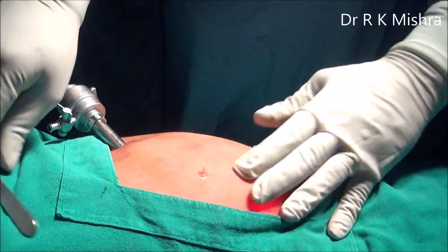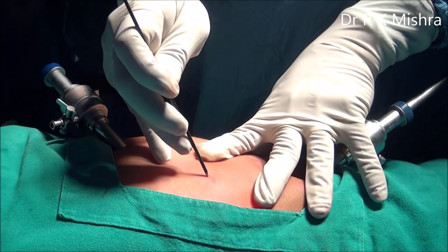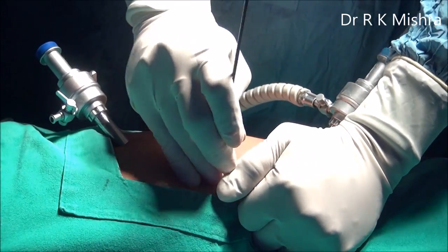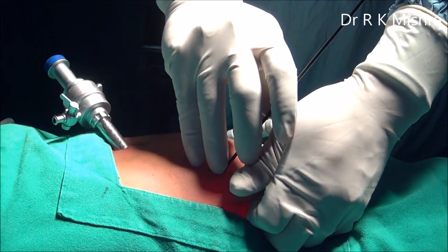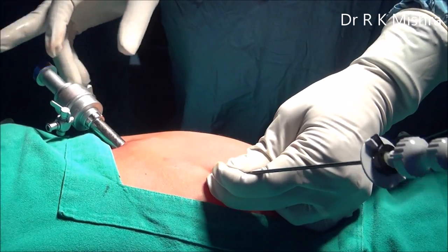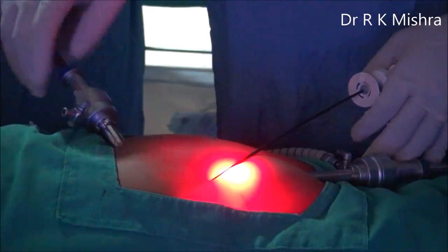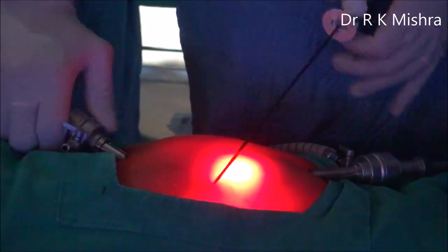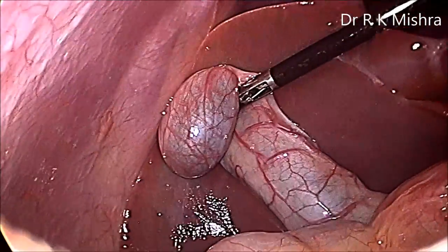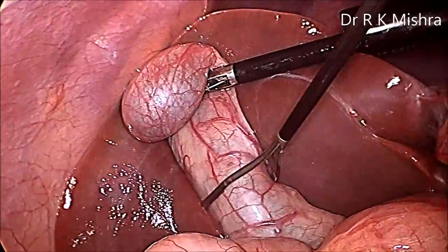For elevation, just one millimeter nick is needed — only one millimeter, no scar. This is the Striker mini alligator; it goes percutaneously. With these instruments only we will perform both the cholecystectomy and appendicectomy. The Striker mini alligator does not have any port and will not give any scar; no dressing, no cannula is required. We will now hold the gallbladder a little above Hartmann's pouch.